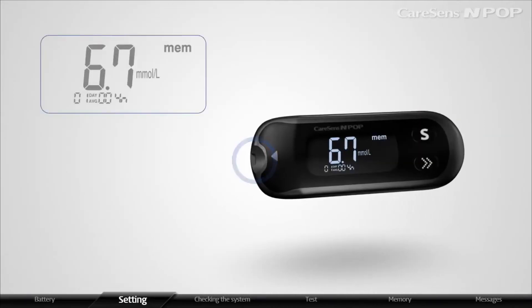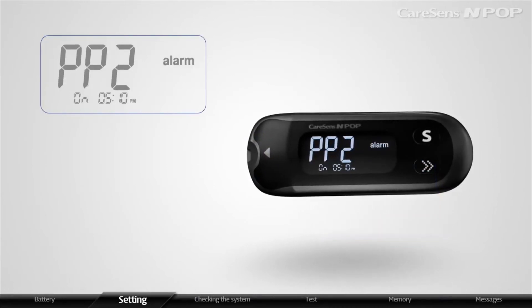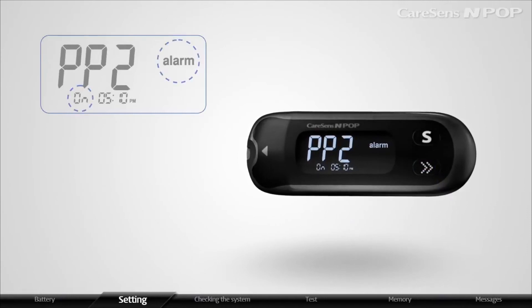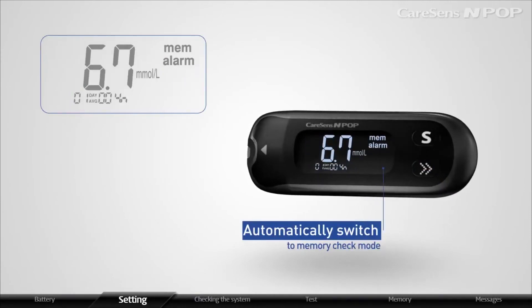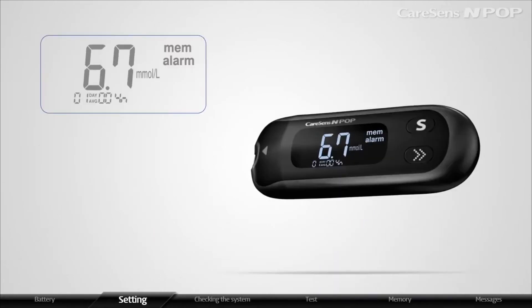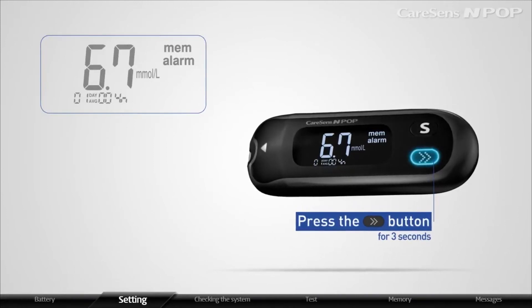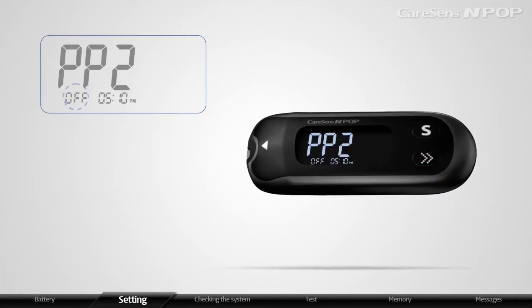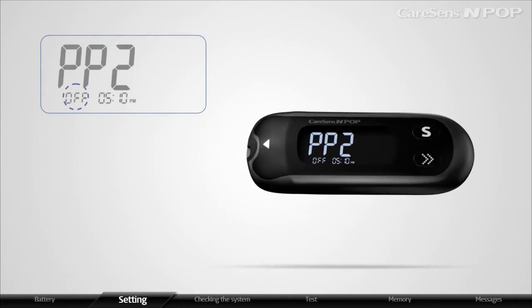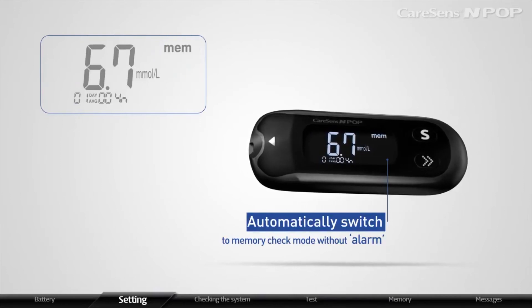When the strip is not inserted, press the arrow button for 3 seconds to set the PP2 alarm. After displaying PP2, ALARM, and ON, the meter will automatically switch to memory check mode. The meter will display ALARM if it is ON. In order to turn off the PP2 alarm, press the arrow button for 3 seconds. After displaying PP2 and OFF, the meter will automatically switch to memory check mode without alarm.